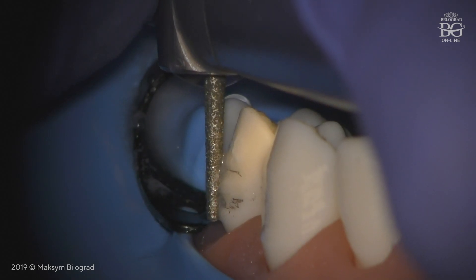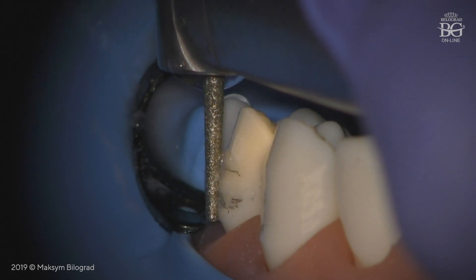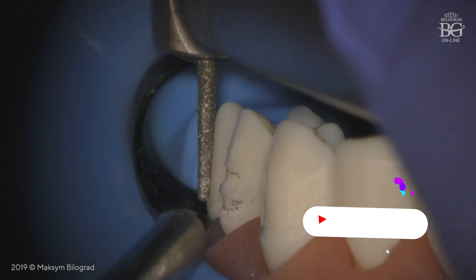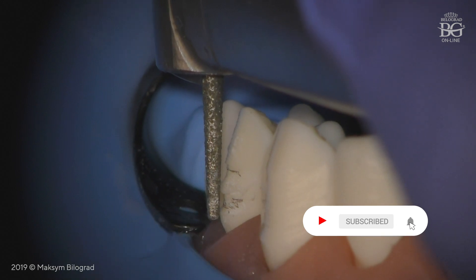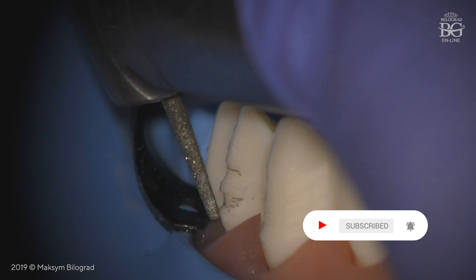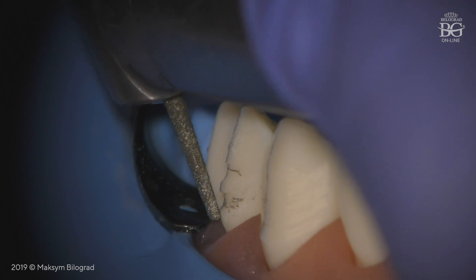I would like to pay your attention: the tip of the burr is not working — the tip of the burr is outside. One of the common mistakes during this step of preparation is that the specialist angulates the burr more to the buccal side when he or she is concentrated on finishing line preparation.